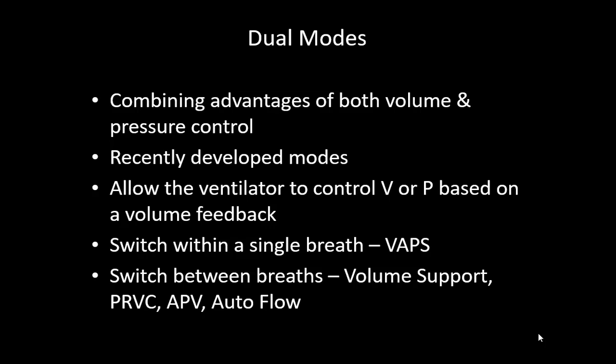There are two types of things that can happen. Changes can occur within a single breath, which is called volume assured pressure support. Or they can switch between two breaths, so it is volume support, PRVC, APV, and auto flow.